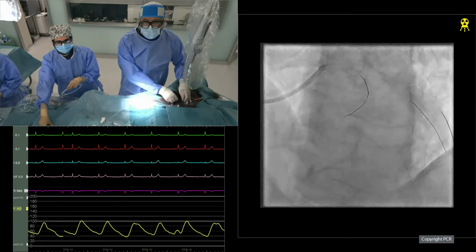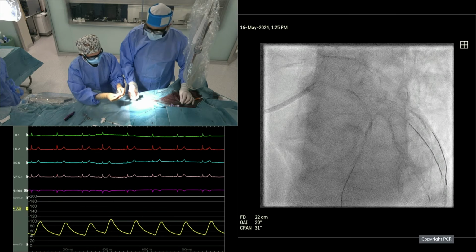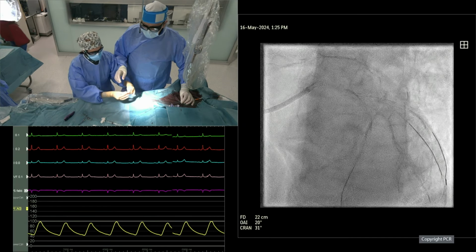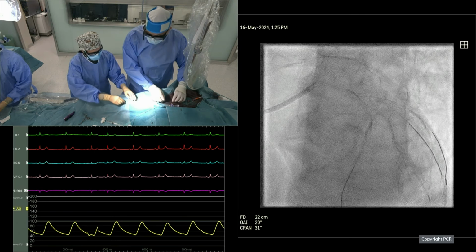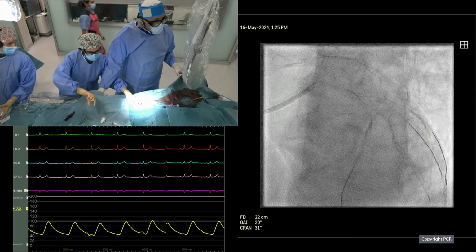Perhaps we can go through some of the questions in the chat box, Evald. Yeah, this is a little outside this case, but there's something about drug-eluting balloons in the LAD, if treatment is needed after. I think it's a little outside the scope of the circ treatment in this case. Yeah, but I don't think Florim wants to miss the opportunity to address this question.